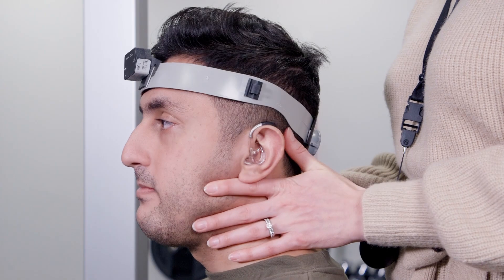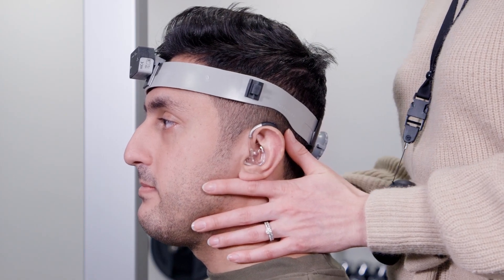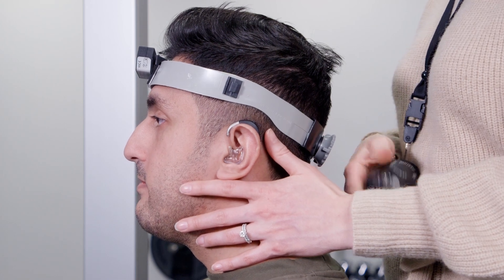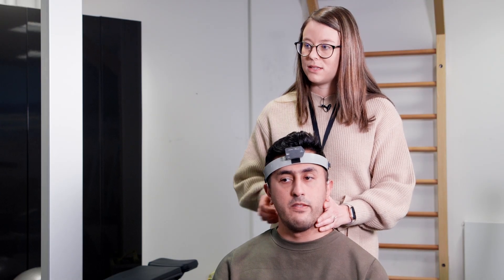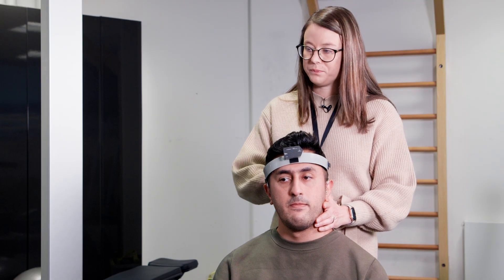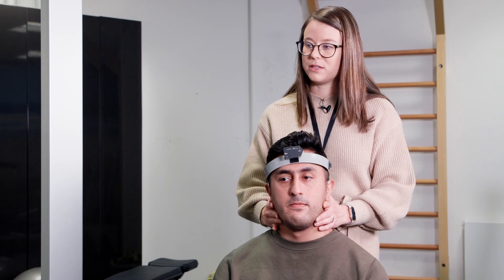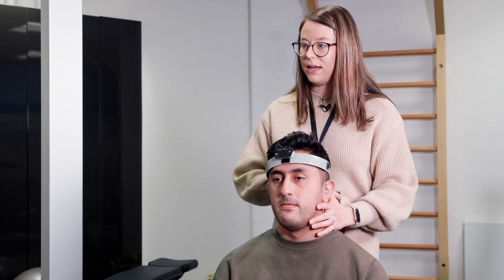I can also just wait out the response on the software. We have a five-second waiting period, so I don't have to press a button if he doesn't know the answer — I just have to wait five seconds. So while I'm doing this test, I'm getting a lot of information about his vestibular ocular reflex in that horizontal or lateral plane.